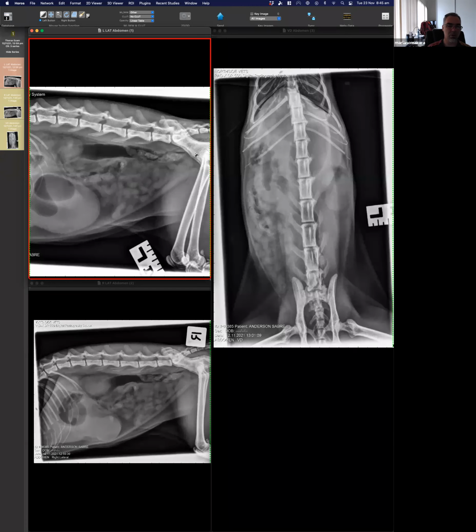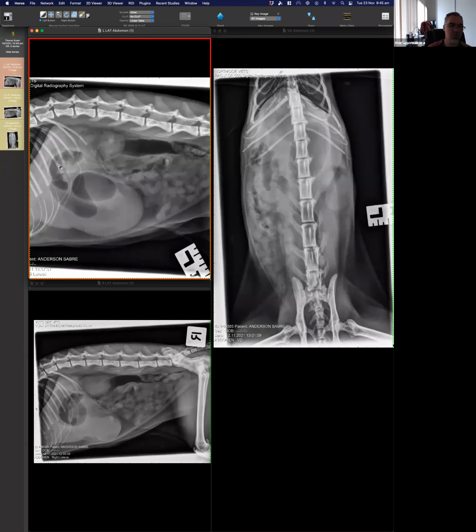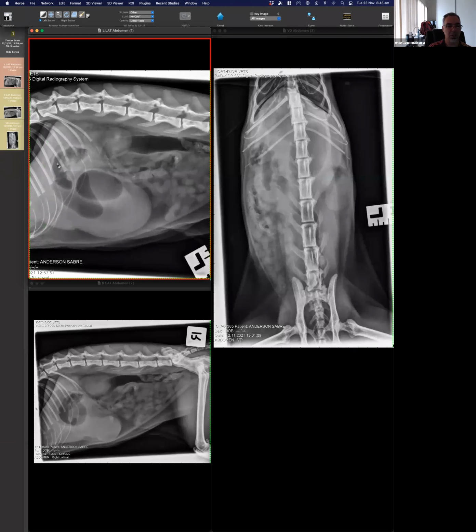So in this case, for example, if you are not certain about that, this would be a perfect case in an exam situation to say, well, radiographically, in a plain radiograph, I cannot differentiate between a mural lesion or a luminal lesion. But you need to have the knowledge to say which is the modality that can answer that question and recommend that modality. So in this case, it would be ultrasound or contrast. Make sense? So then you're saying, this is as much as I know. This is an obstruction. I think the obstruction is there. I don't know what it is, but if you want to know what it is, you should do this. So that's the path.